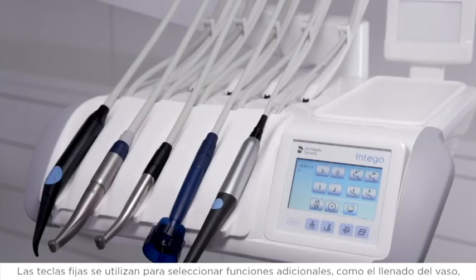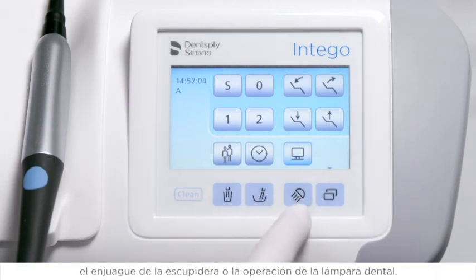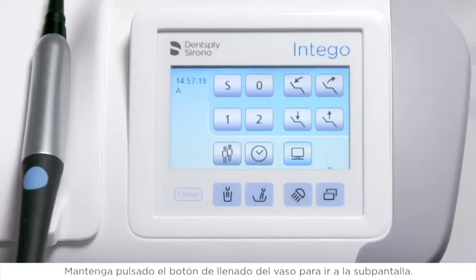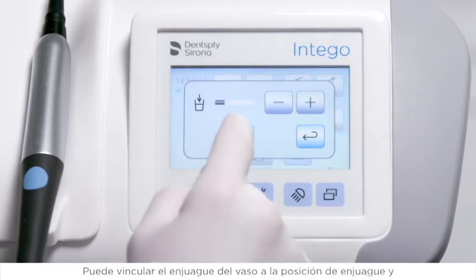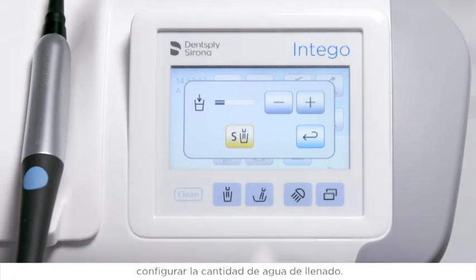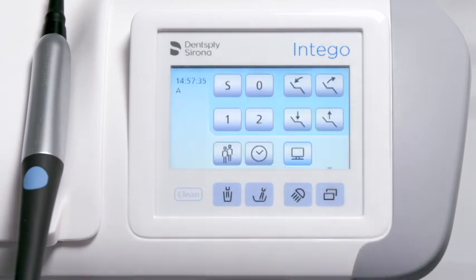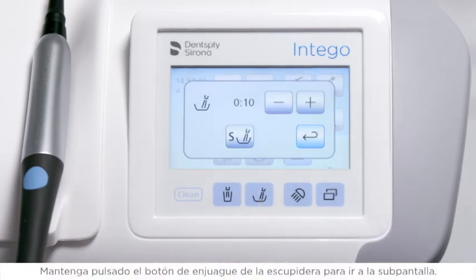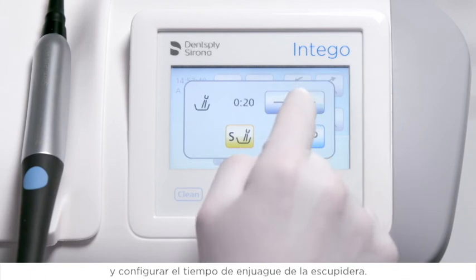The fixed keys are used to select additional functions such as tumbler filler, cuspidor flushing, or operation of the dental operating light. You activate the functions by briefly pressing the button. Press and hold the tumbler filling button to go to the sub-screen, where you can link the rinsing of the tumbler to the rinsing position and set the filling quantity. Press and hold the cuspidor flushing button to go to the sub-screen, where you can link the activation of rinsing to the rinsing position and set the time of cuspidor flushing.